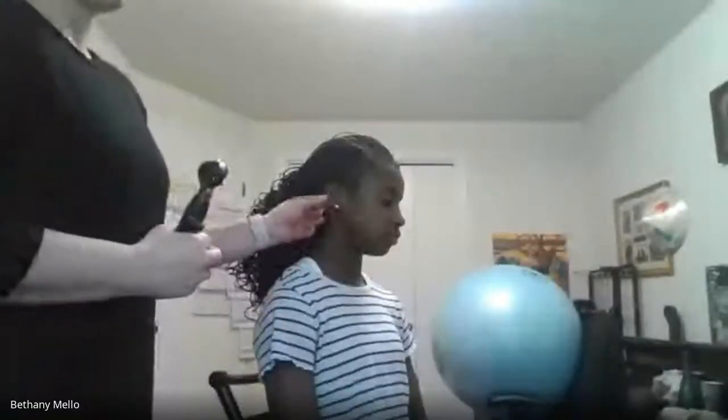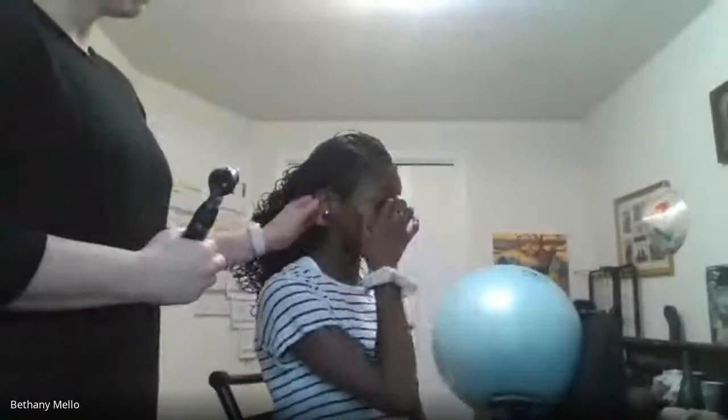So with a child her age, and an adult, you're going to grab the helix area here, the auricle, and you're going to pull it upward and back. And what that's going to do is it's going to help straighten that auditory canal. In infants and children, pretty much up to 3 years old, you're actually going to turn your head this way. What you're going to do is you're going to pull this down and back.